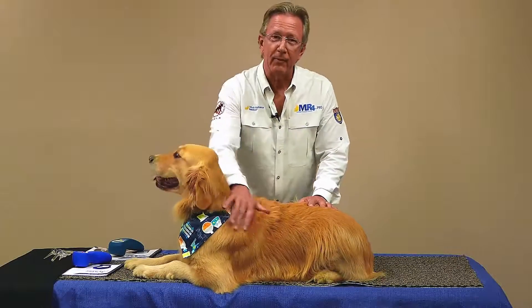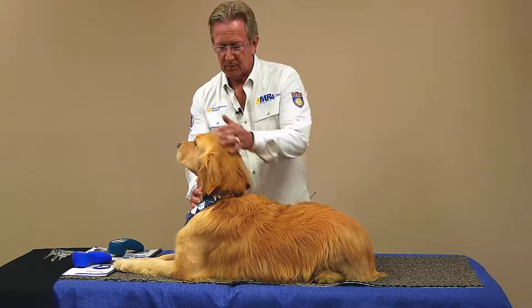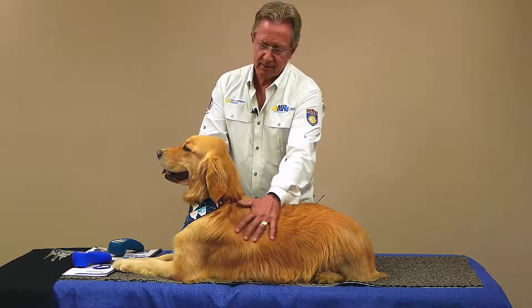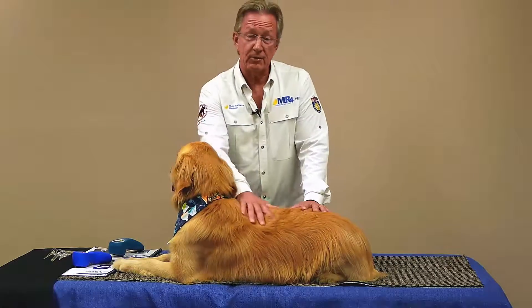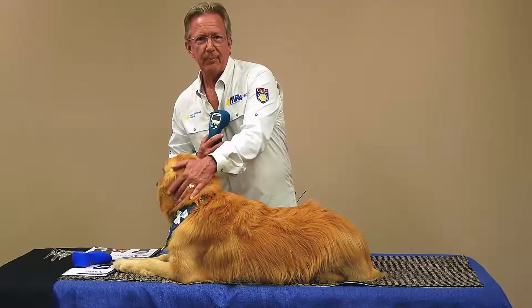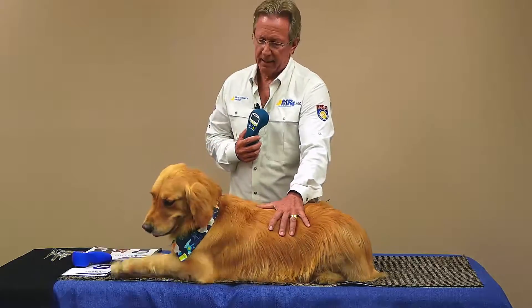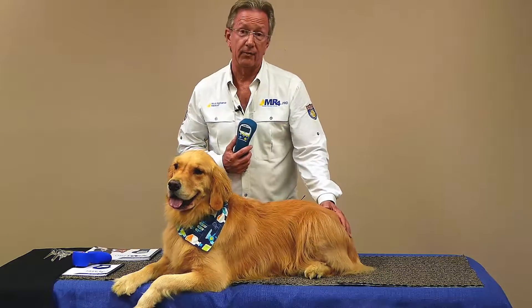Mark Strong back with you with Multi Radiance Medical. Today we have Mojito — one of those classic beautiful goldens that you love to have as a family dog, but this dog has a lot of issues as it gets older. Laser therapy is a wonderful way to keep your dog really feeling good by addressing issues that come along, whether it's an injury or just natural processes like arthritis.